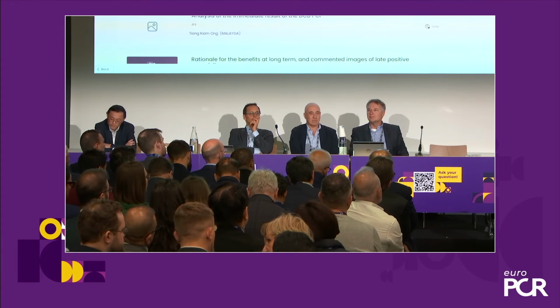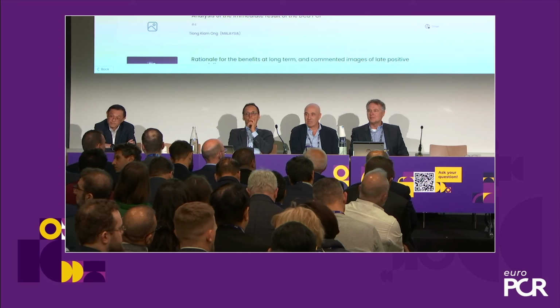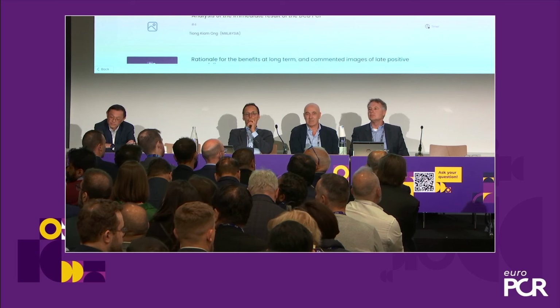But I also think if you take a slightly different approach, which is you have slightly more liberal aspiration of the thrombus and you deliver a glycoprotein 2B3A inhibitor into the coronary artery and you do your predilatations until you've got a wide open vessel and no obvious visible thrombus, you're probably going to get good delivery of drug to the vessel wall. So far I've been very happy with the results. We will see in a more systematic manner when we start a trial. Thank you. Indeed, it's very important that you don't use the balloon as a direct balloon. You have to prepare the lesion, dilate, get flow, and then you go with your DCB.